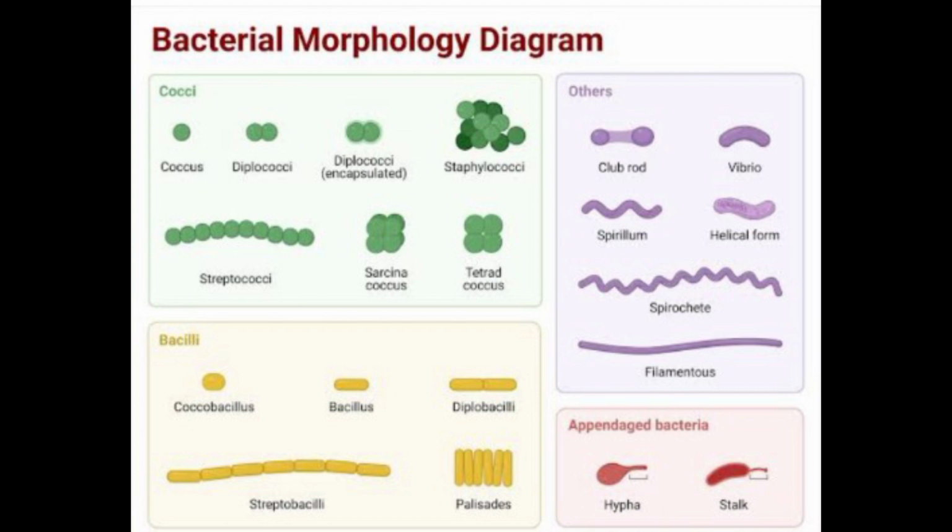Microscopic examination of the smear: acid-fast bacilli appear red, the color of the carbol fuchsin. The background, including pus cells and epithelial cells, appears blue, the color of methylene blue.